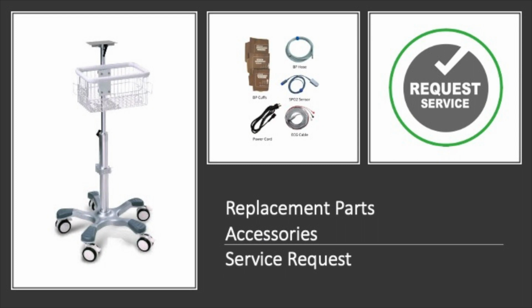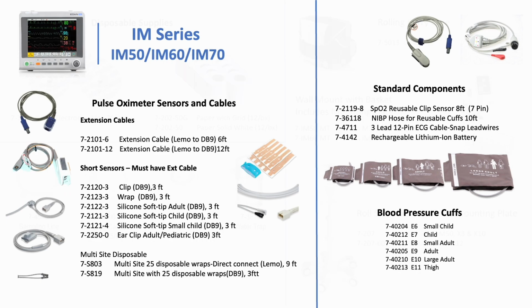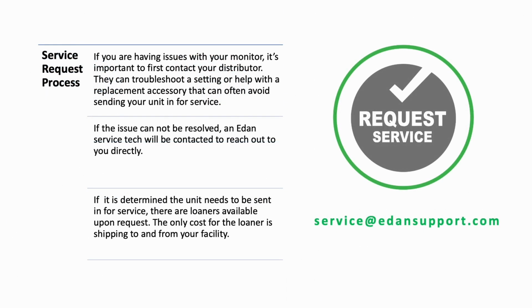The following pages include X-Series accessories, IM-Series accessories, disposable supplies, mounting options, along with instructions for obtaining service.